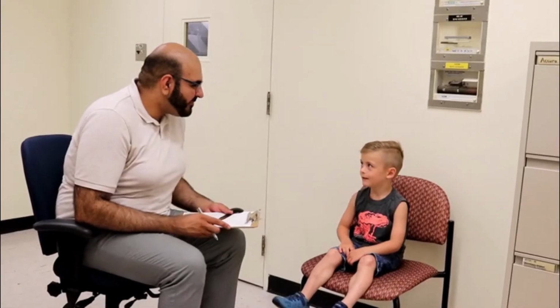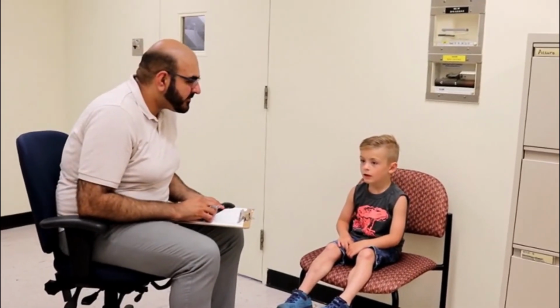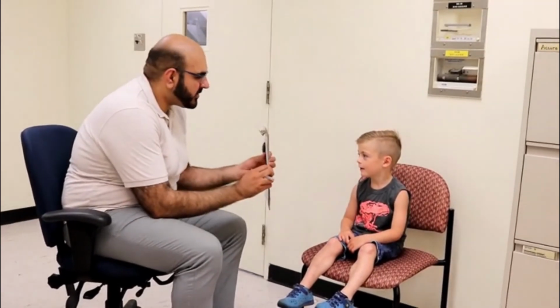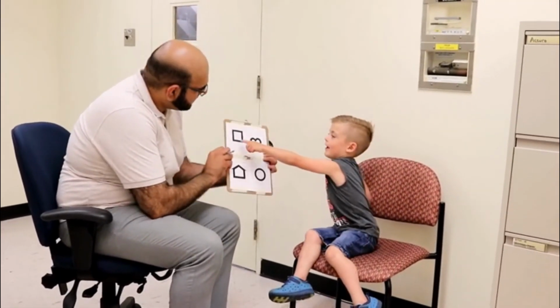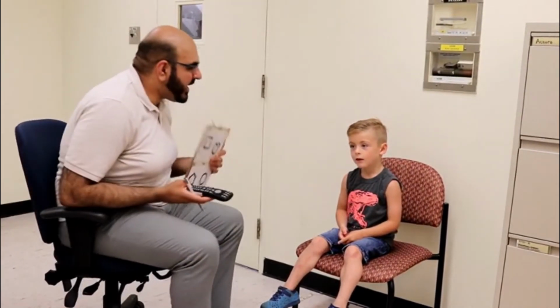My name is Brad, and today we're going to check your vision. Are you ready? Excellent. Okay, look at the screen. Can you tell me what that is? A square. That's a square. Can you show it to me on here? That's very good. Okay, I'm going to change it up again. Can you tell me what that is?